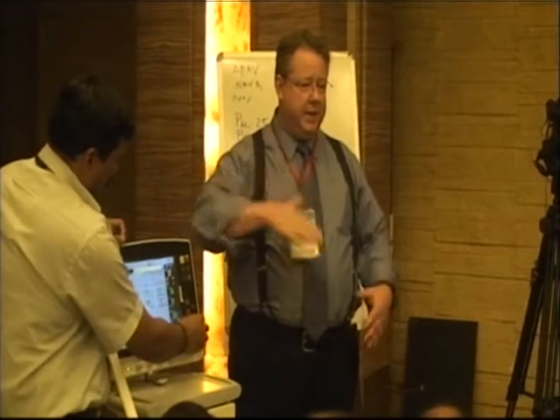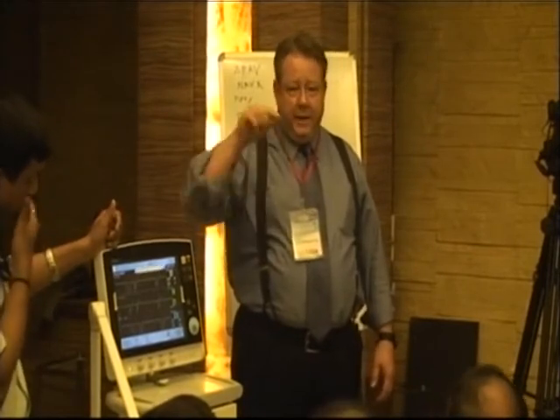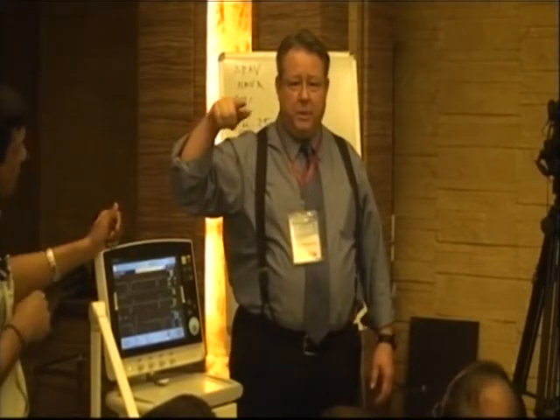Airway pressure release is that you maintain a high peak. They breathe across that spontaneously, so they're getting some CO2 clearance with that. They do have a little bit of extra stretch when they do that. But then you release it so they can exhale. Remember, exhalation is the passive mode for most of our patients. You release it so they can exhale for a matter of a half to 1 second. You don't ever get all the way back to baseline, otherwise you're losing all the improvement that you just had and all the peak that you acquired.